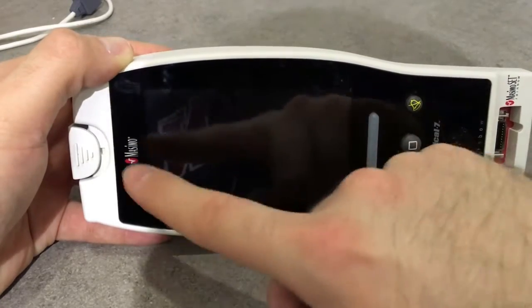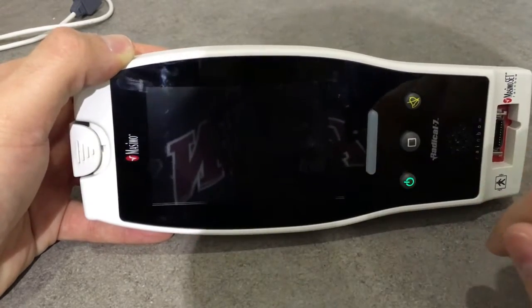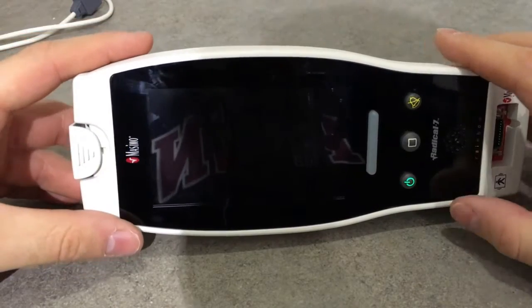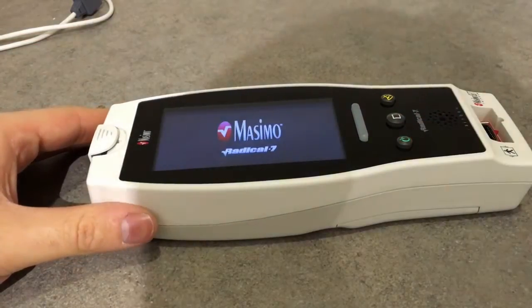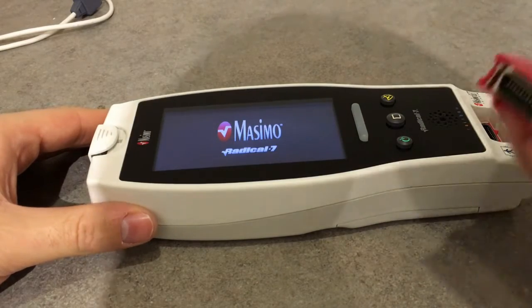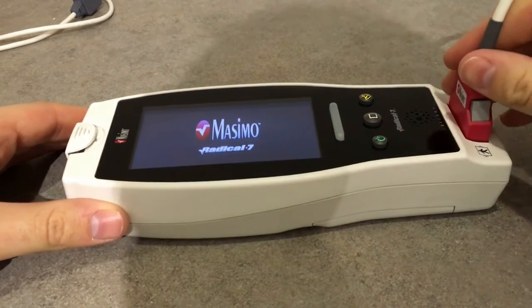We also have this very large touchscreen. So let's turn it on — it takes a while to boot up, so we can connect the cables in the meanwhile.